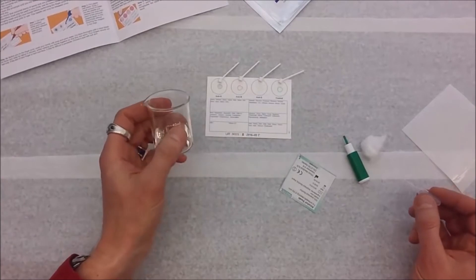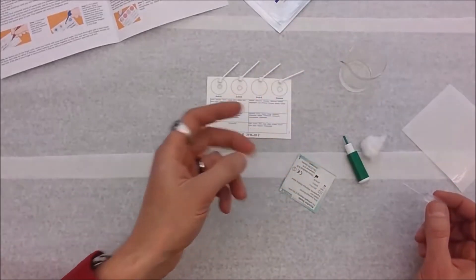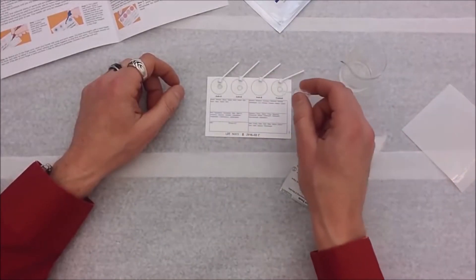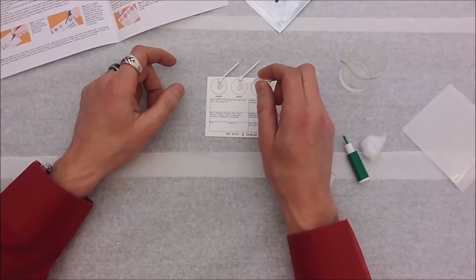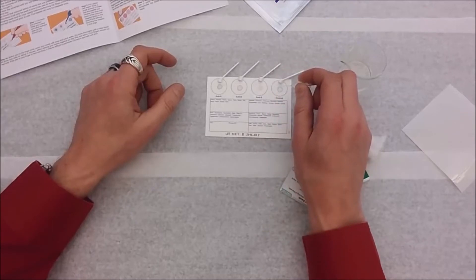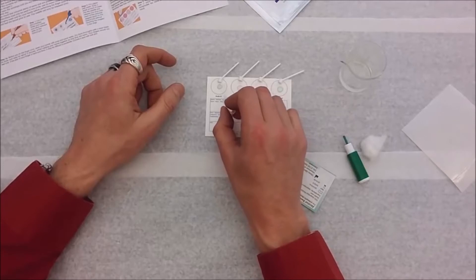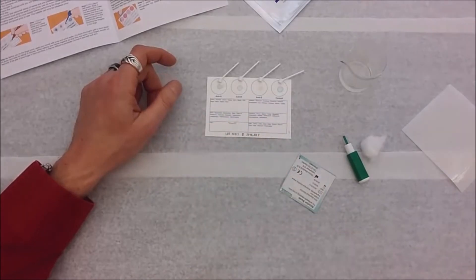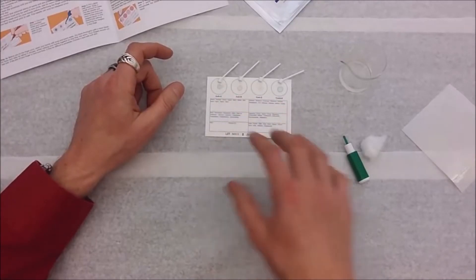There are two things the kit doesn't come with: one is water — just a little cup of tap water is fine — and of course the other is your blood, which you'll have to poke your finger to get. The directions tell me to put two drops of water onto each of these little dried colored drops on the slide. The importance of this is it starts to dissolve the solution — the antibodies come out of that solution and are ready to go when the blood shows up. I won't use this pipette again; I don't want to cross-contaminate.